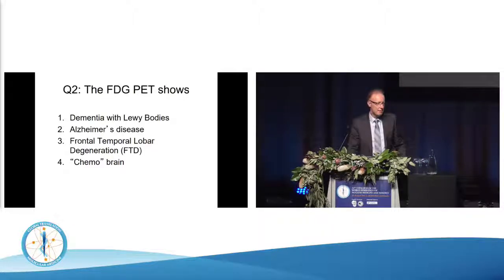Okay, despite the fact this person is in their early 50s, it's a typical FDG PET of Alzheimer's disease. As I mentioned in my talk, in young people with Alzheimer's disease, the findings are quite distinct, as they are in this case. Chemo brain is a nebulous concept. People having various forms of chemo do get some executive dysfunction and other somewhat vague cognitive problems, but they don't get PET scans that look like that.